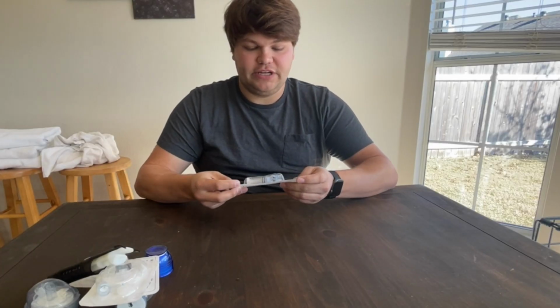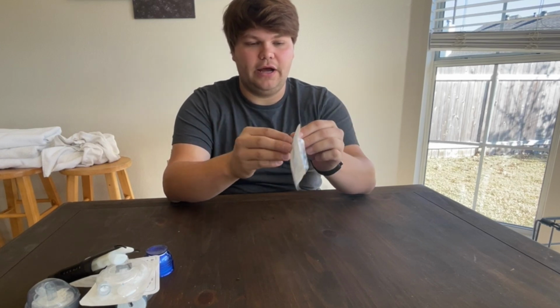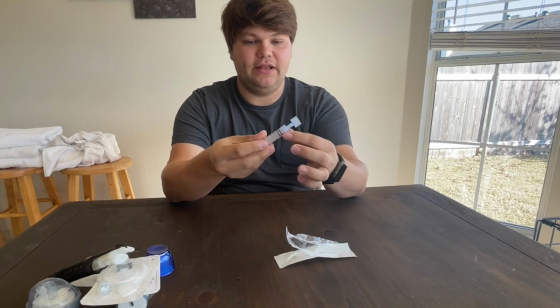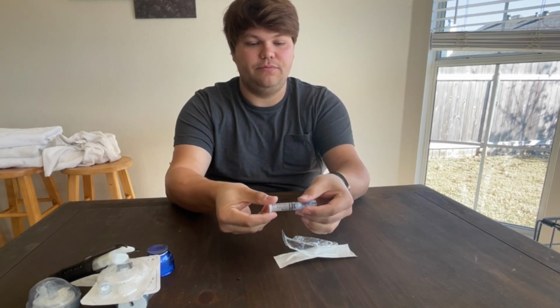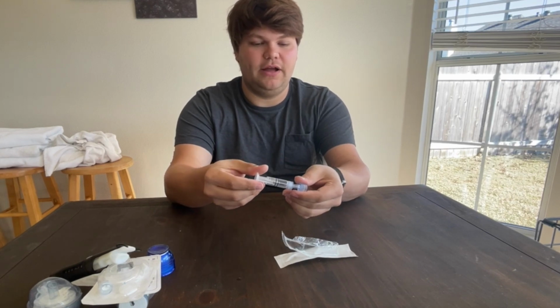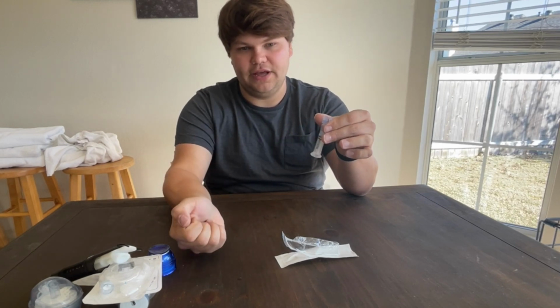So first, just to get started, this is a Medtronic MiniMed Reservoir. I'm going to go ahead and open it because I do need to change my infusion set. I like these. You just pop it on. First of all, you pull the plunger back to fill it with air, pop your insulin vial on, pump in the air, turn it upside down, and then fill it with your insulin.